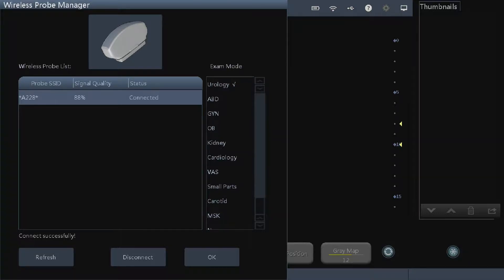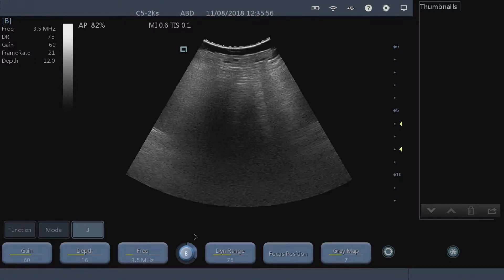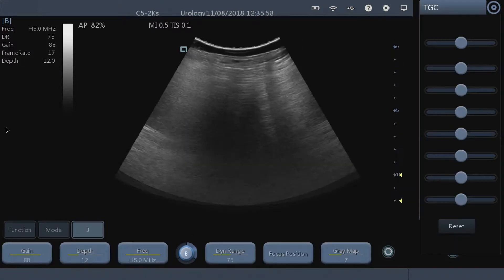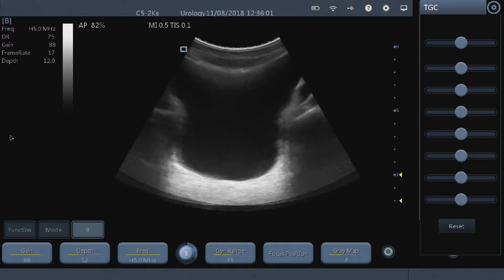To take a bladder volume measurement in the Qsino D8 window software, we need to make sure that we're in the urology mode. So we'll go to the exam mode and click OK.